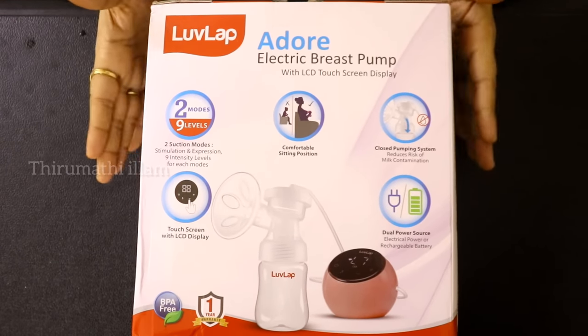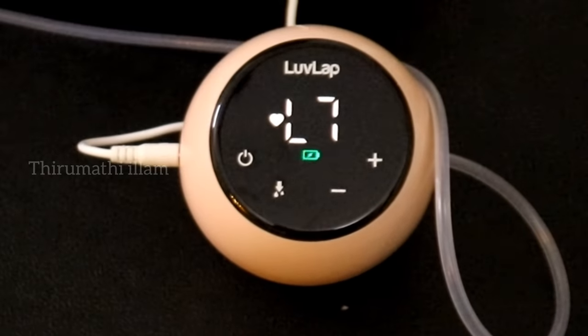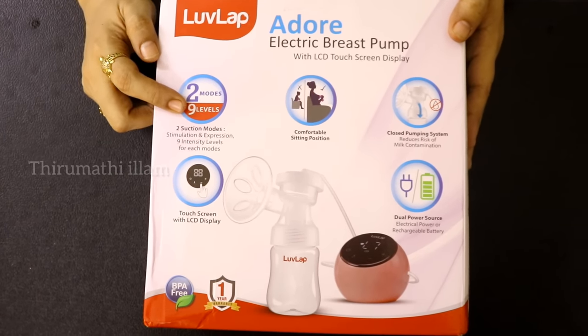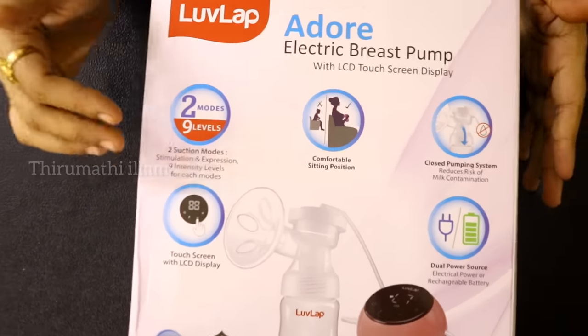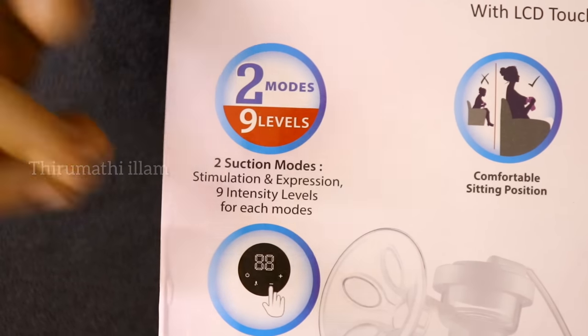You can see the plus points. You can see the LCD touch screen display. We can see the levels of the process. There are 2 modes and 9 levels. There are stimulation modes with up to 9 levels of suction power. So you can choose any suction power level.